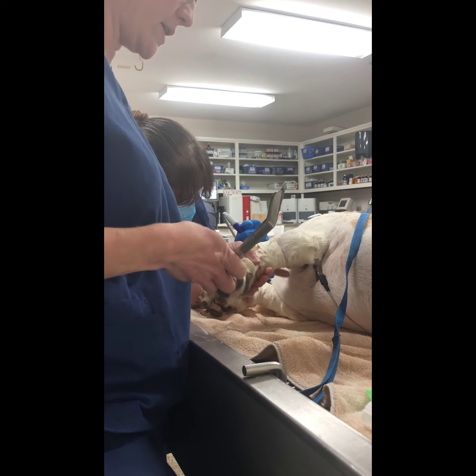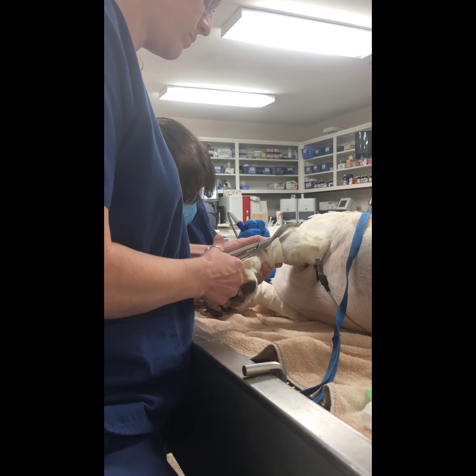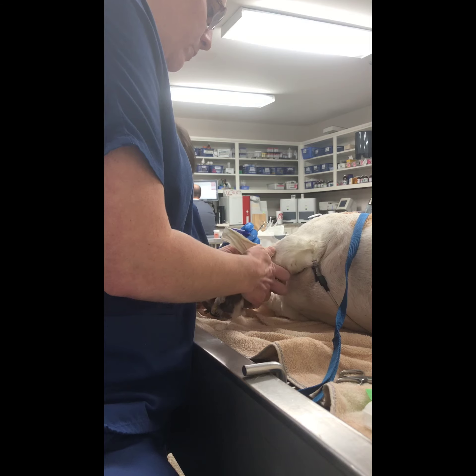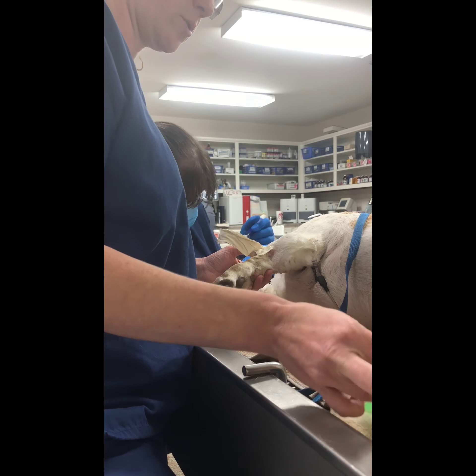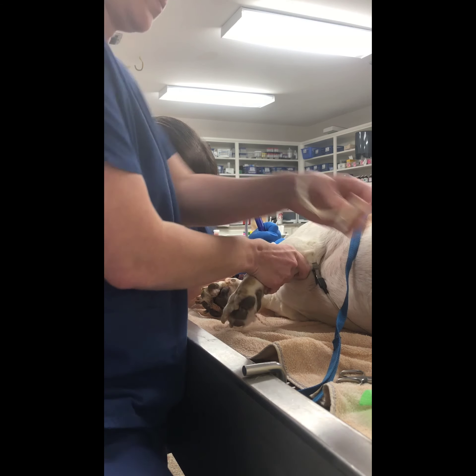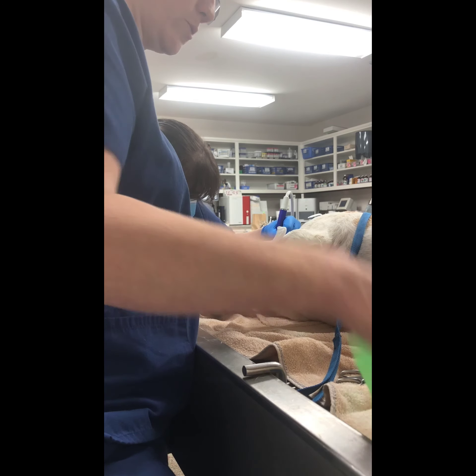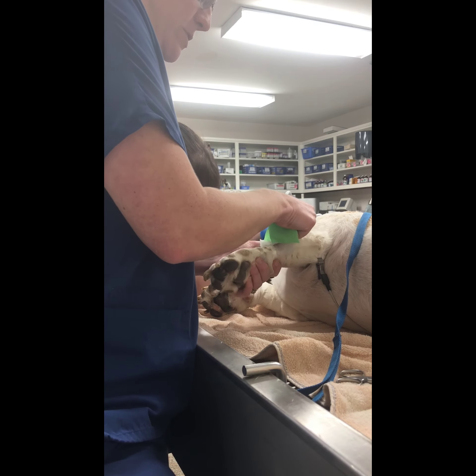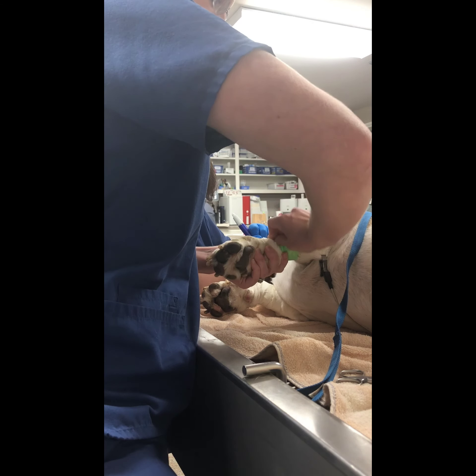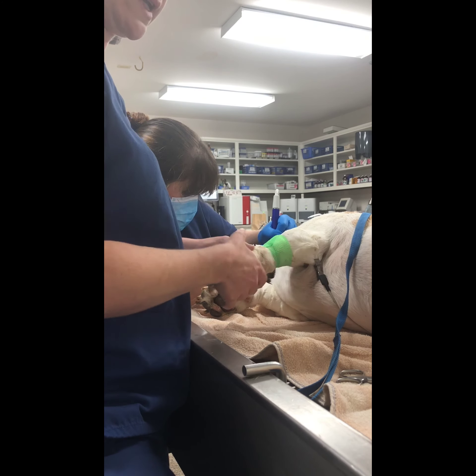I'm going to go ahead and remove this catheter — I've got some bandage scissors right here. When I remove this catheter, I'm going to use a little piece of gauze to hold pressure on the site, and then we normally add a little piece of vet wrap just as a little pressure wrap for a few minutes to ensure that it is completely occluded and it's not going to bleed out. And that was removing an IV catheter.